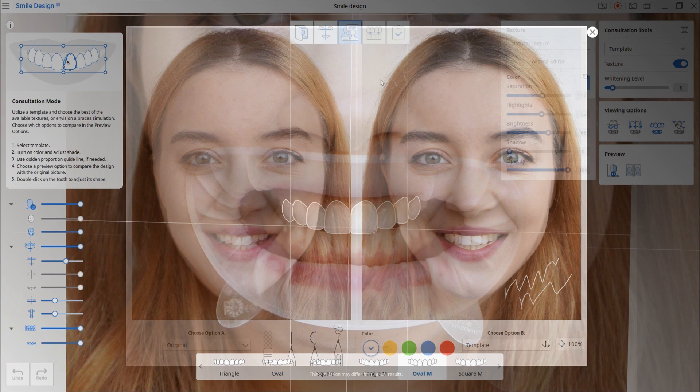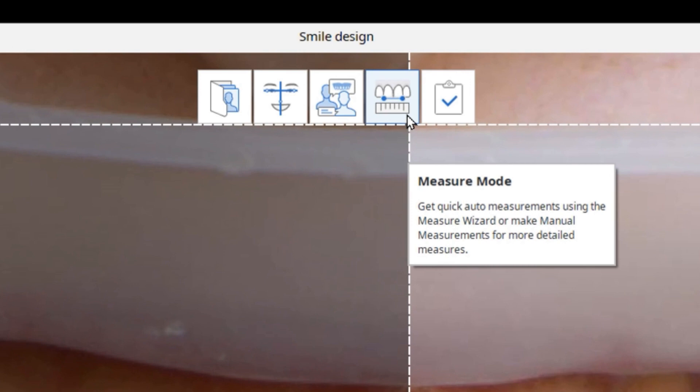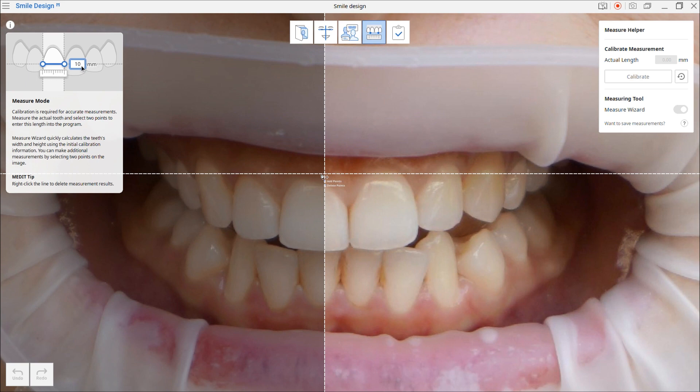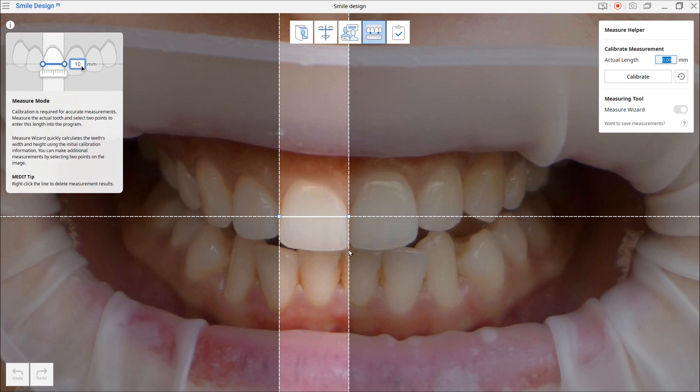Medit Smile Design now has the Measure Wizard feature. At this stage, you can calculate teeth measurements to easily deliver measurement results to the lab. First, select two points on the tooth in the image that corresponds to the tooth in real life. Then use a Vernier Caliper or MediScan for Clinics' measure feature to measure the actual tooth's length. Enter this length next to actual length and calibrate the measurement. When calibration is finished, each tooth's ratio measurement will be automatically calculated.